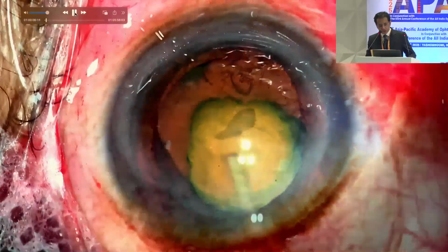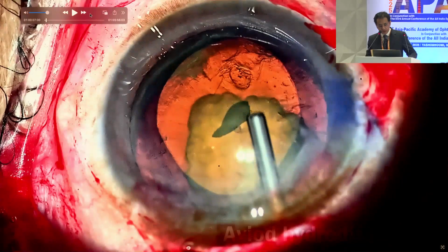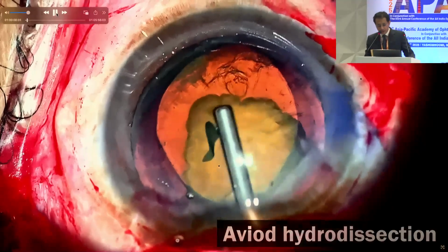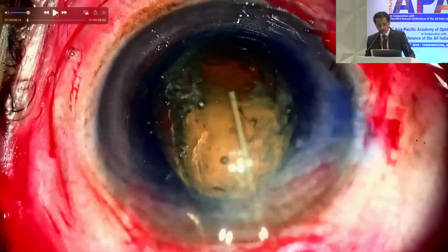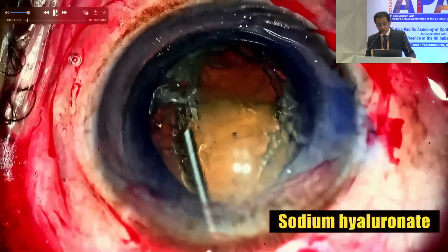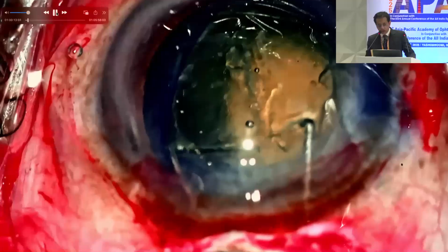Now this is a posterior polar cataract. In these situations, as we all know, there is a higher risk of a posterior capsular tear, and of course we avoid hydrodissection. One change which I have made here is an oval rhexis, which is longer in the longitudinal area and shorter from the side. This was proposed by Dr. Kiranjit Singh for phacoemulsification, but I feel you can very well use this for manual SICS as well.